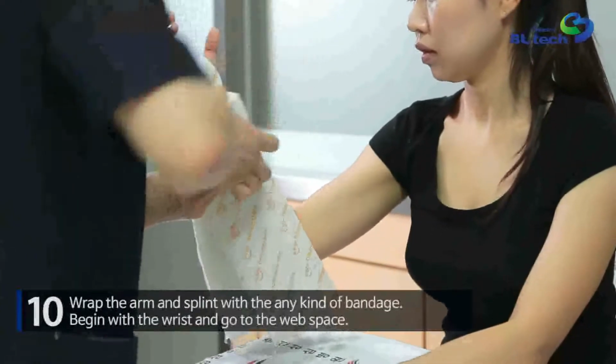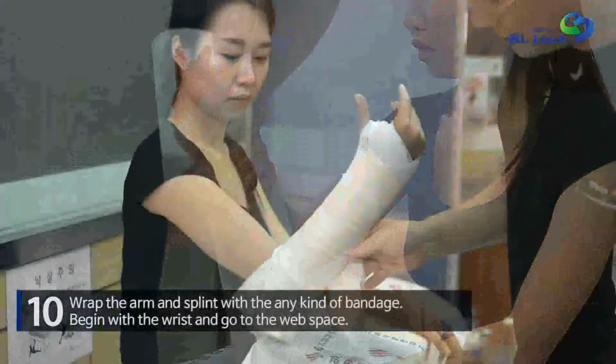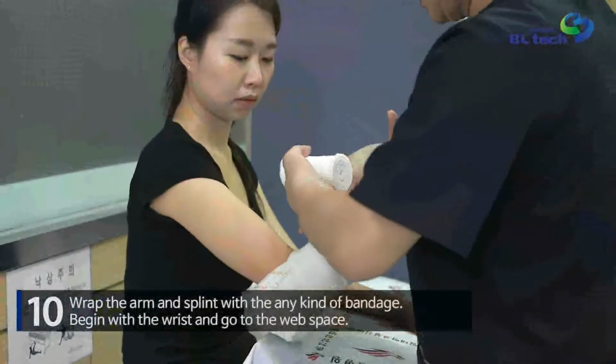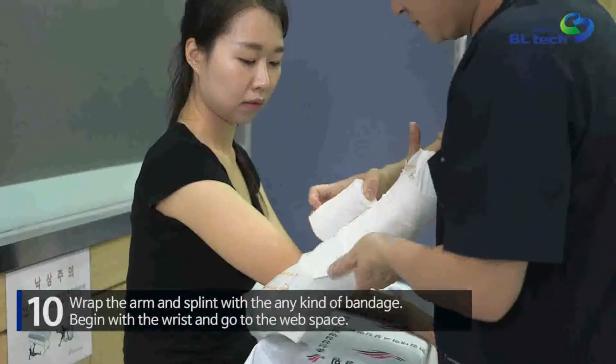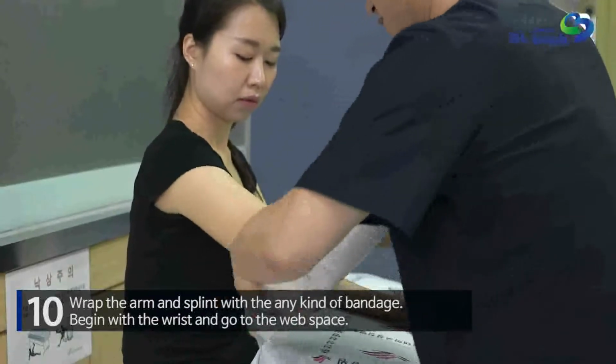Wrap the arm and splint with any kind of bandage. Begin with the wrist and go to the web space. For an ideal immobilization, repeat this step again. Proceed to overlap 50% of the bandage toward the elbow.